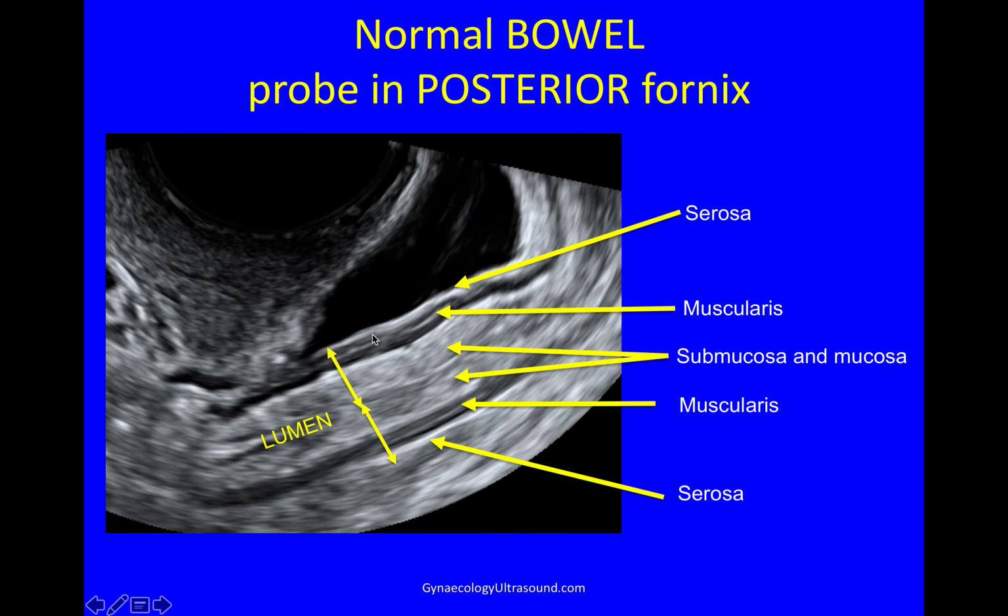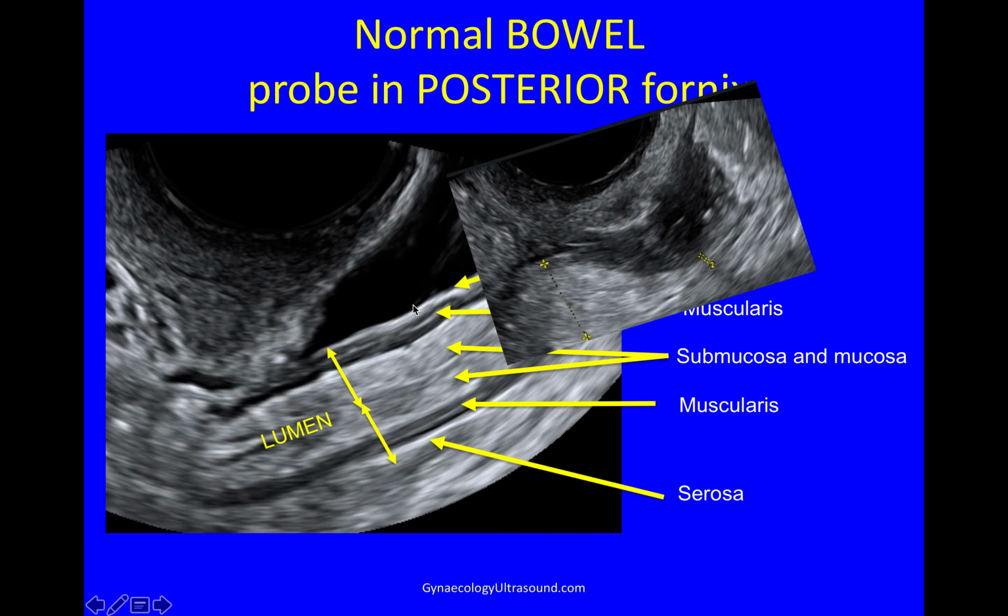So the lumen of the bowel is here. Endometriosis is always in the anterior wall. And this is what it looks like. A little bit of normal muscularis. So this is the layer that we're looking for, muscularis. There it's normal, there it's normal, and here you can see this thick lump of DIE that has caused smooth muscle hyperplasia.